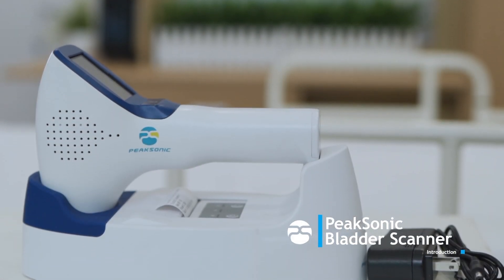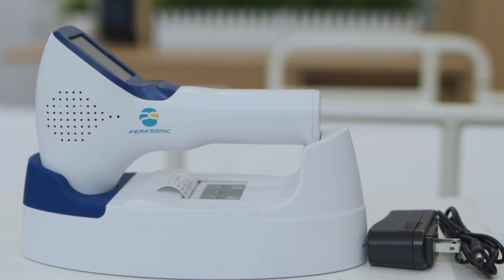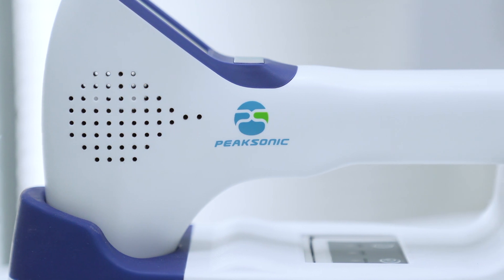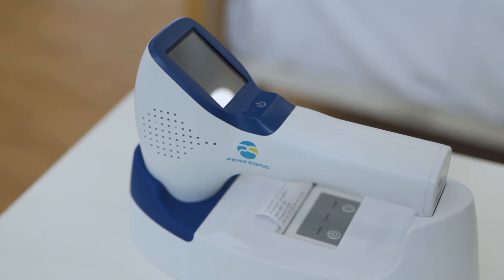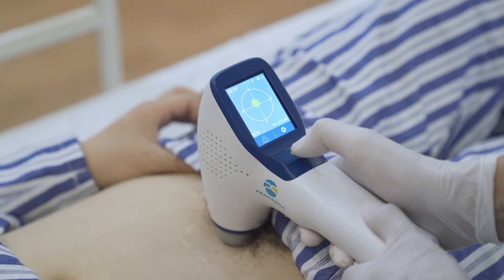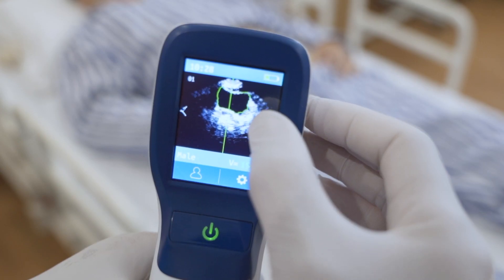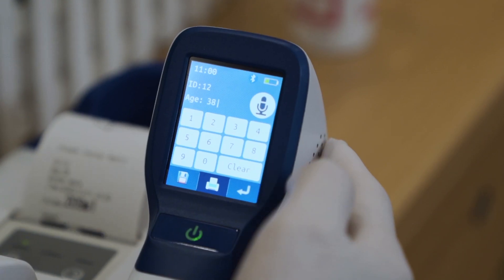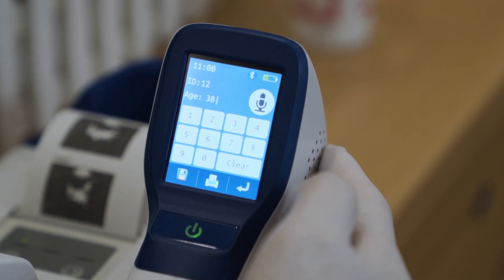Peak Sonic Bladder Scanner is suitable for the measurement of bladder volume in primary medical facilities and nursing homes. It provides the basis for the implementation of clinical catheterisation and evaluates the residual amount of urine after urination. It helps to make auxiliary diagnosis for bladder and kidney function diseases. The instrument is also suitable for people with lower body disability and loss of self-urination function to master the timing of urination.